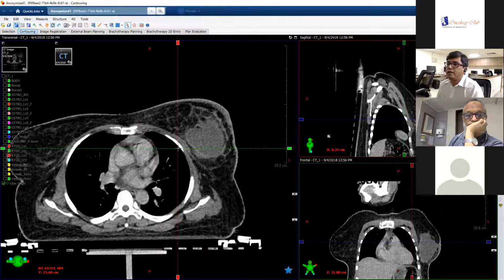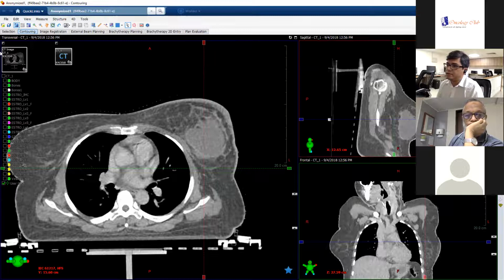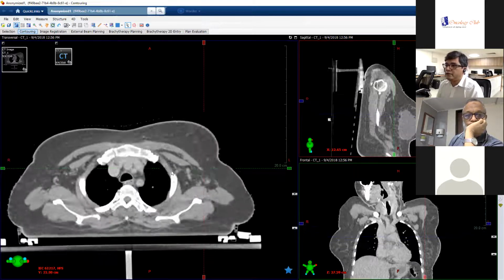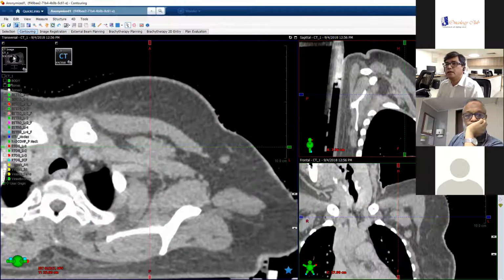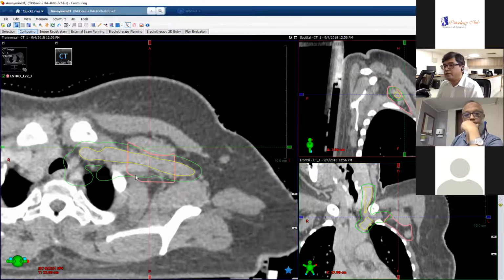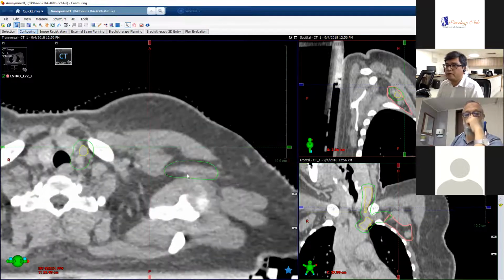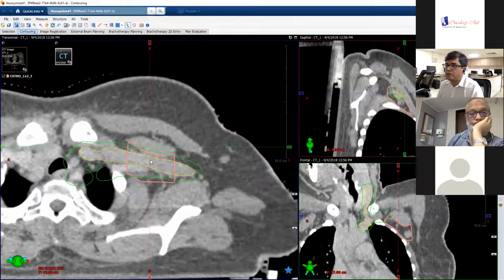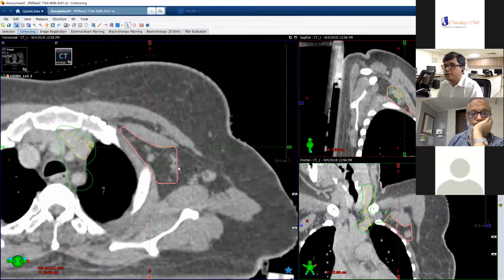But going back to where I showed you how the surgeon enters this particular region, if we just identify the pectoralis minor muscle and the vessels, give them a 5 millimeter margin, and we look at the ESTRO level 2 CTV, this is fine. This is all you need to do. You just need to figure out where these vessels are crossing into or behind the pectoralis minor, where they're exiting, and this is all the region that you need to treat.